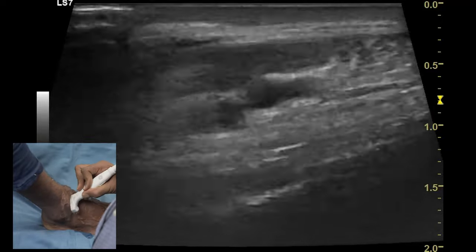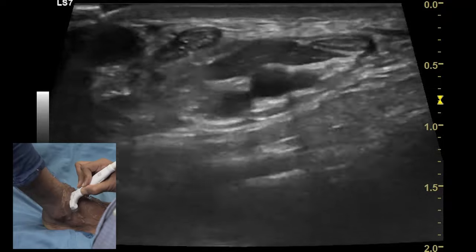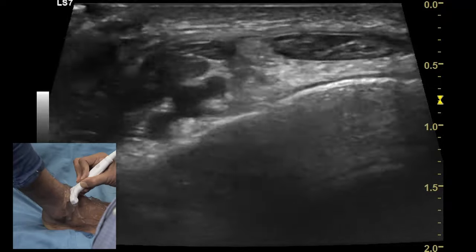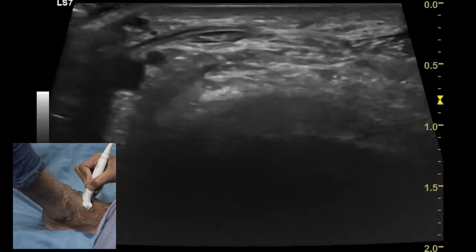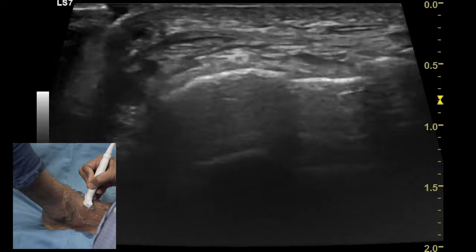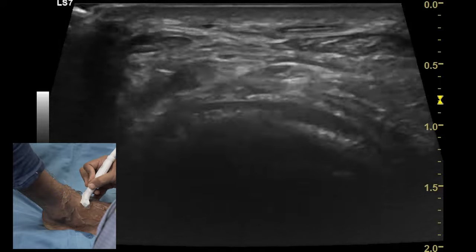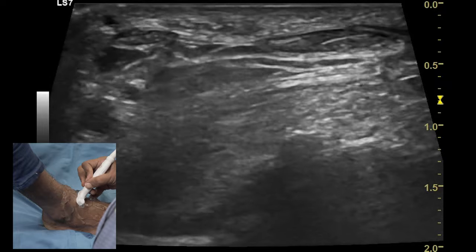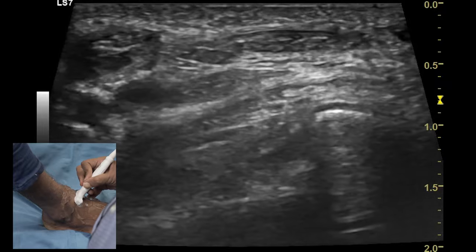This is the superior extensor retinaculum. When you move down distally one can also appreciate the inferior extensor retinaculum. The main function of this retinaculum is to prevent the bowstringing of the tendons of the ankle.